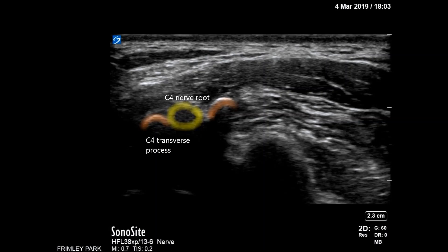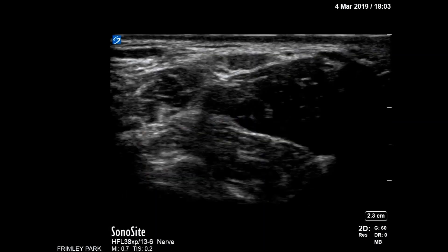You can see the nerve root of C4 entering the transverse process. In this picture, you can see the sternomastoid and the supraclavicular nerves behind it, resting on top of the middle scalene muscle.